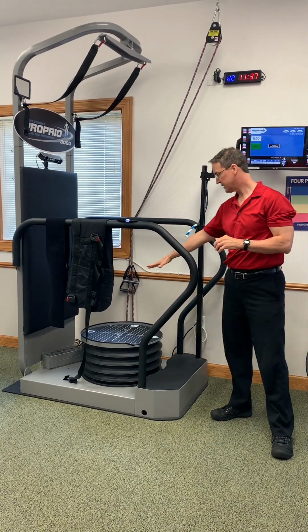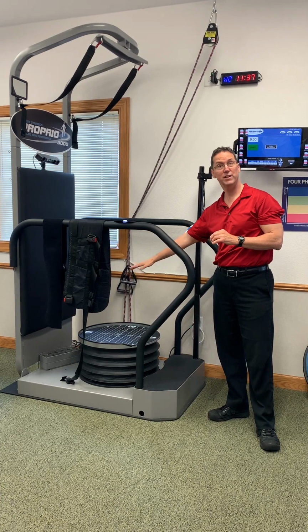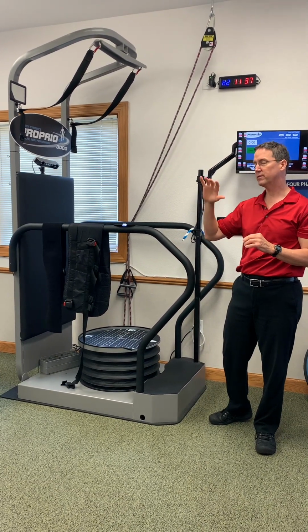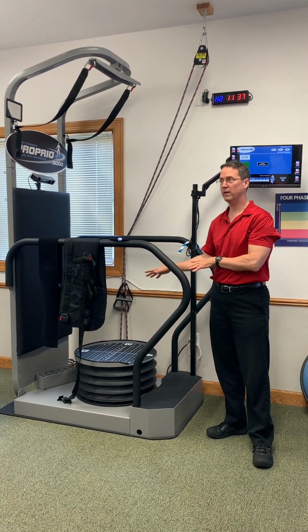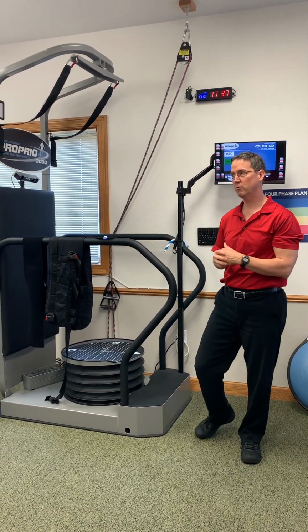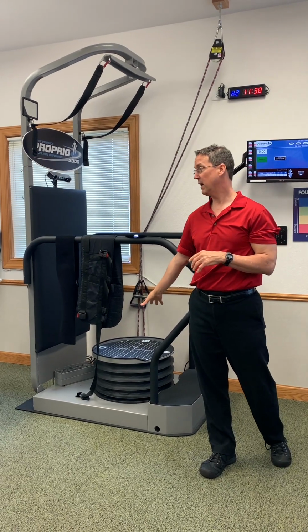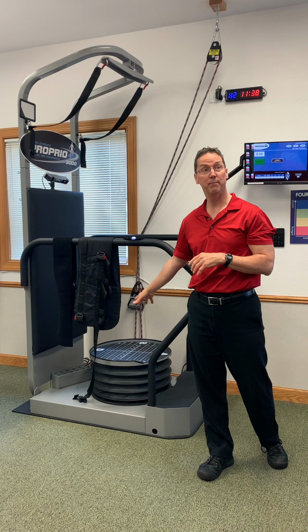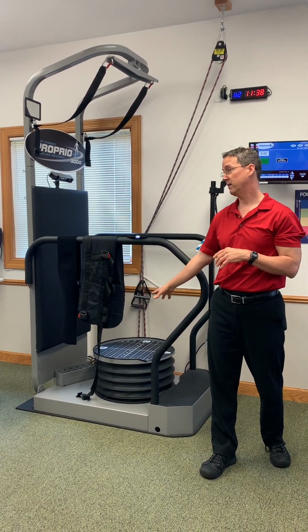What this does is it's a reactionary balance device, so the platform moves underneath you, which is the unique nature of it. This is the only device north of Chicago. I don't say that to say, oh my goodness, this is impressive. I'm just saying this is a rarity that we got this in here, and the clinic was at a point where we could purchase this. Quite frankly, we don't make any more money because we have this. However, we think patients like it enough and it keeps them engaged and it makes additional changes that we can get than without. So that's why we have it.